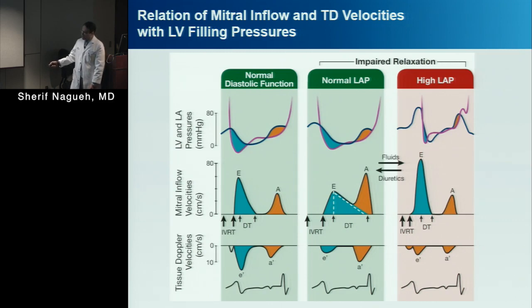The main advantage of these signals over the mitral inflow is you can see that the mitral inflow is tracking changes in LAP. This one doesn't track much the change in LAP. It's reduced here and it is still reduced here.